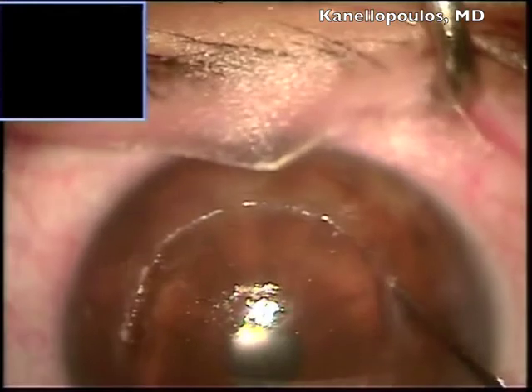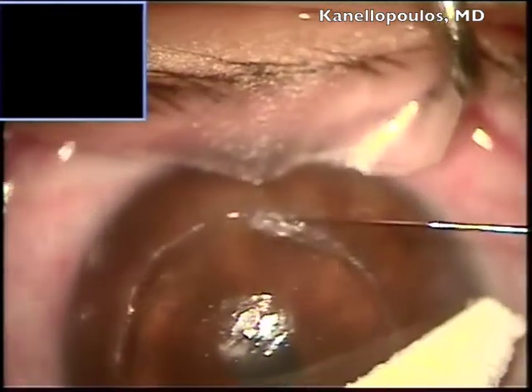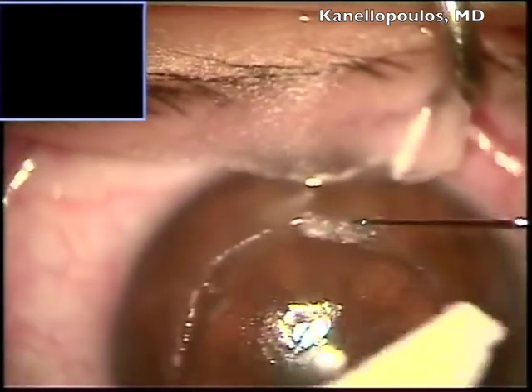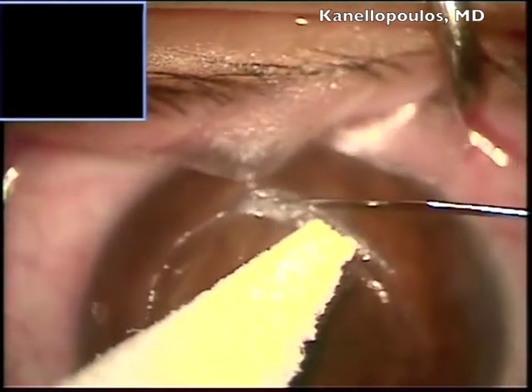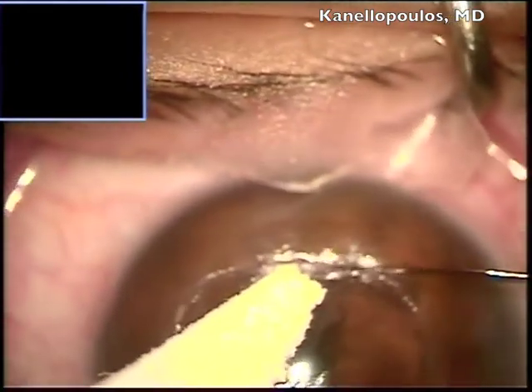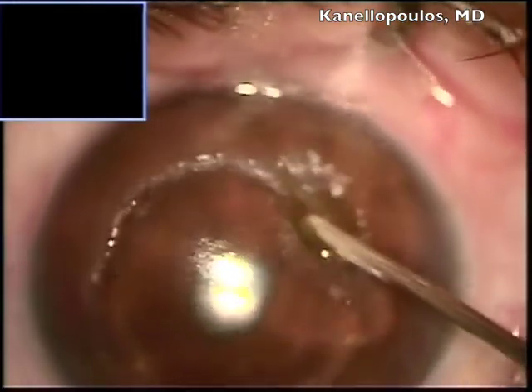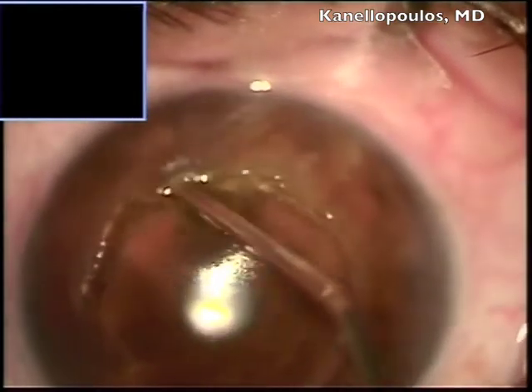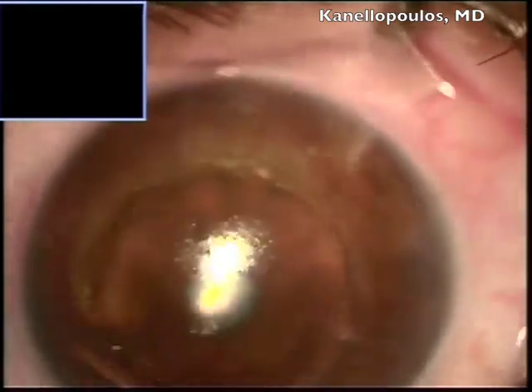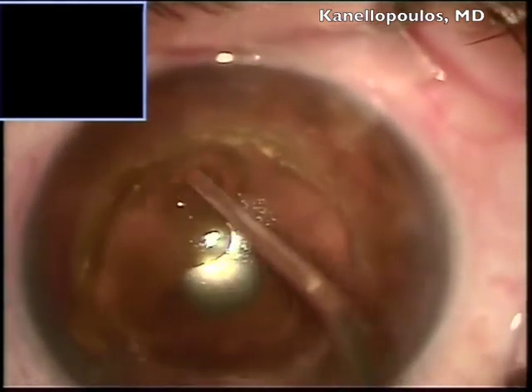So carefully going manually — there is some resistance, as you can see, in the areas where the original sutures were placed. Obviously the tissue there is more fibrotic, both on the graft and on the host. This is, for example, an area of resistance. I'm spending a lot of time to show you this because we like to expose all of this graft-host interface.